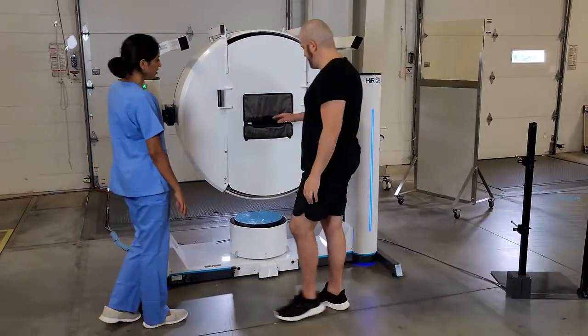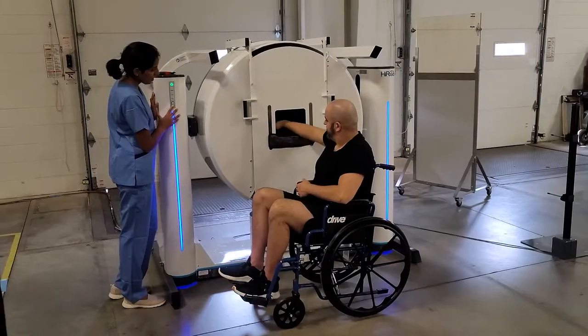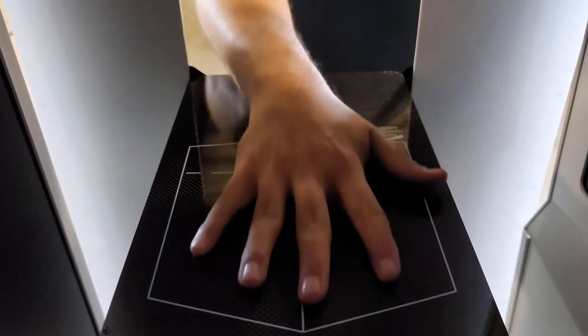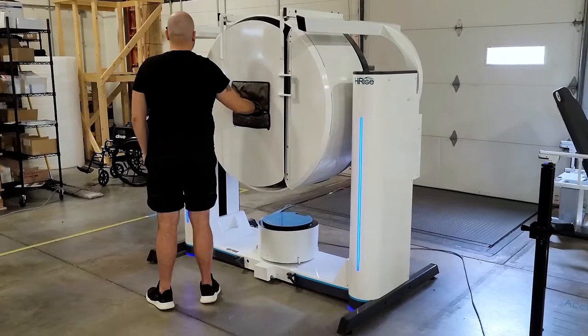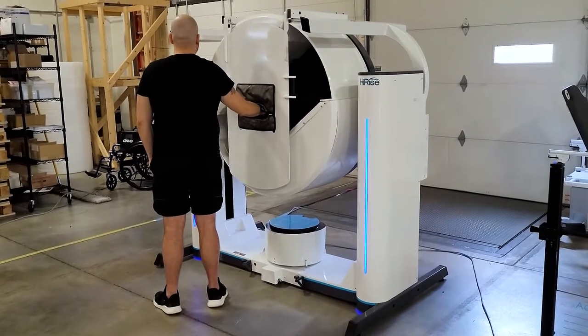Once flipped, the gantry height can be adjusted for the patient. The patient places the region of interest within the field of view border printed on a hand positioner. An upper extremity scan takes about 30 seconds, with X-ray firing for about 4 seconds.